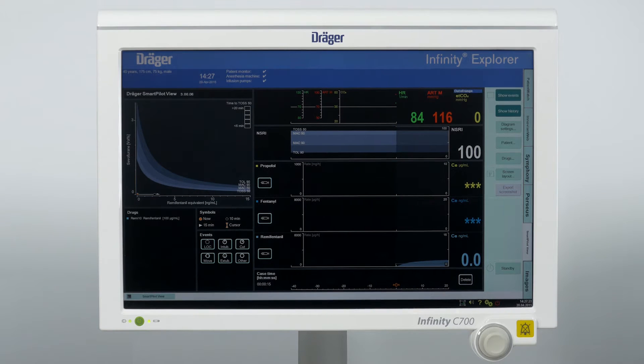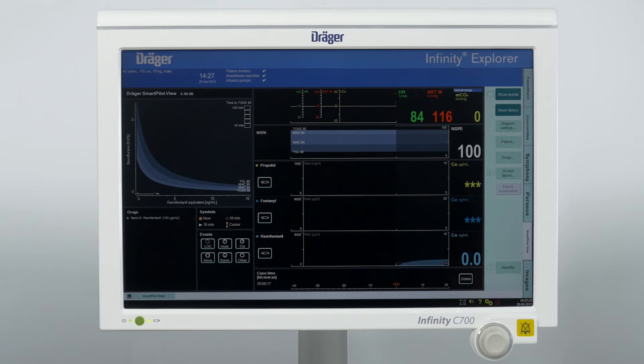Now SmartPilotView is active and will continue to display the calculated anesthesia level in the main operating room.